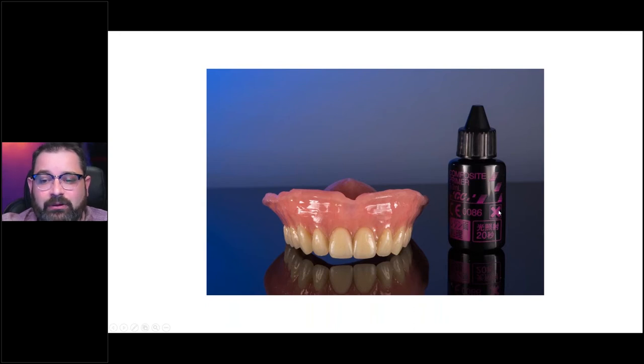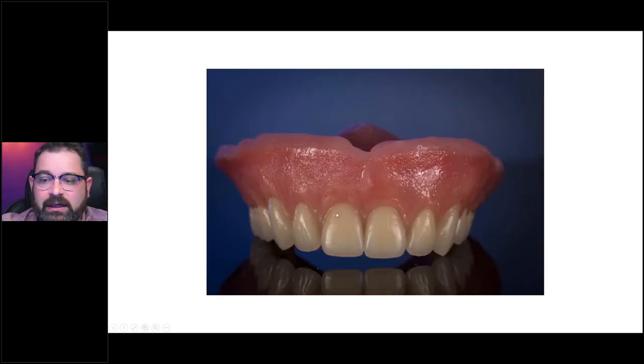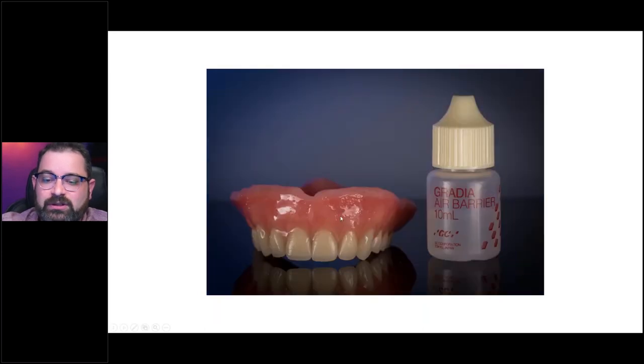Light cure for one minute and then you're ready to apply your composite. You can try to do it in layers if you want to. In this case I've done it in layers — one layer, second layer, third layer — and you quickly tack cure between the layers for about a minute just so they don't shift. When you're dealing with printed monolithic restorations, chances are you're going to be doing everything in one layer, so just apply it and cure afterwards.